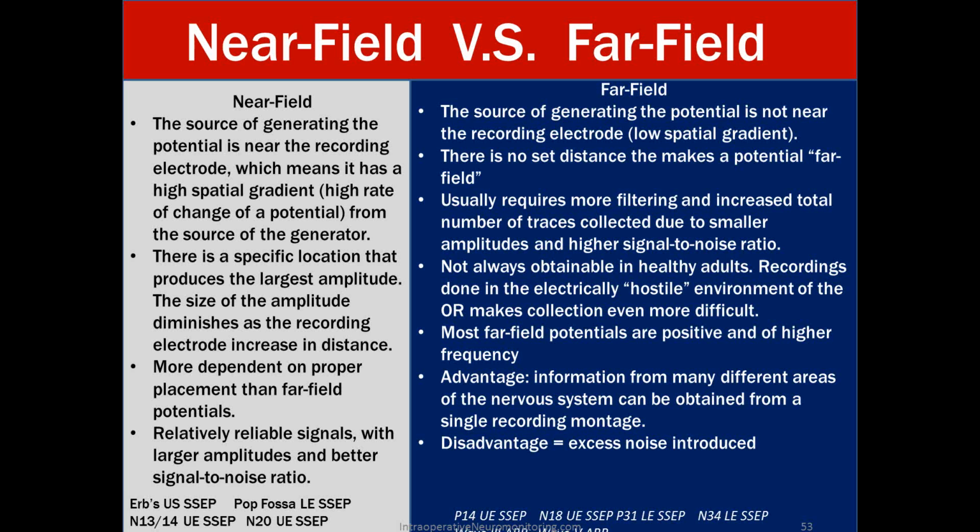So we'll go over that in a little bit, but the smaller the amplitude, the worse it is to collect, because noise just causes a lot of problems with it, and the more sweeps or traces we have to take to try to eliminate that. It's not always obtainable in healthy adults. Recording done in the electrical hostile environment of the OR makes collecting these even more difficult.